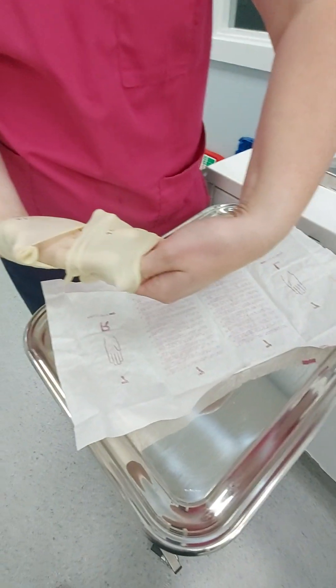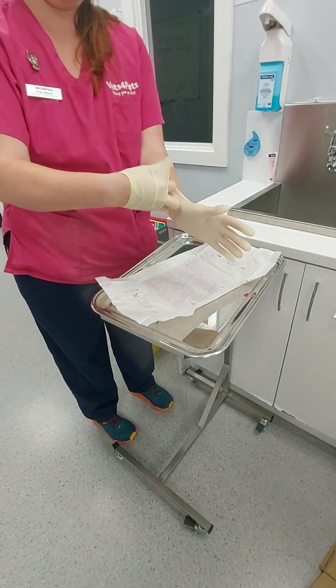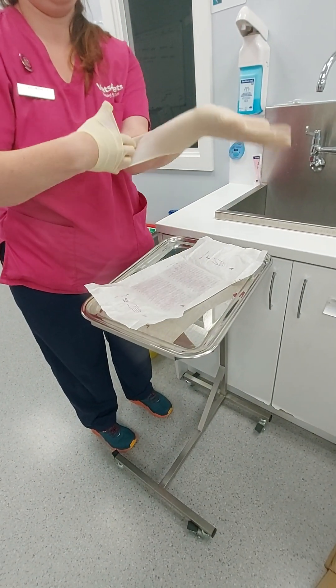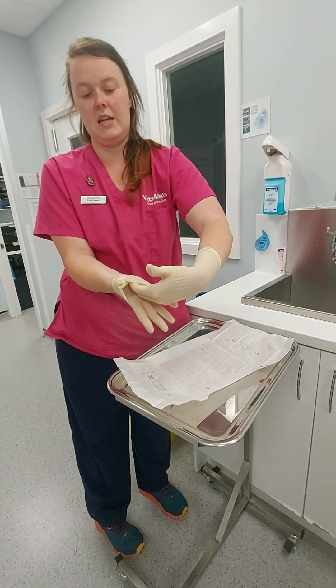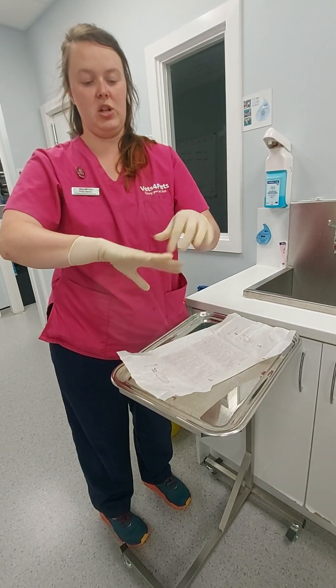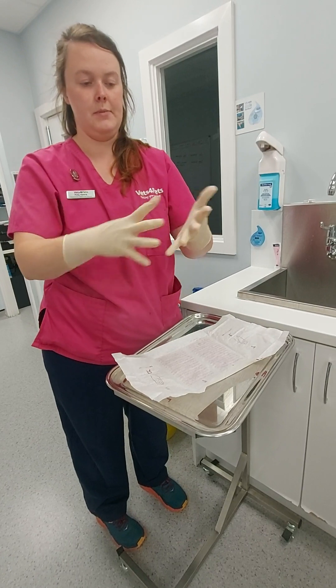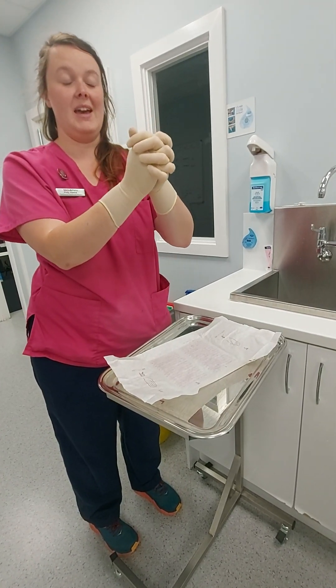So I'll just show where we've ended up there — easing ourselves into that. So that's my left hand. Thumb's still in here. Nice and clean underneath there. Up, and then once you're in, you can readjust fingers as necessary. Keep hands above your waist, do not touch your uniform, and then you're fully scrubbed in.